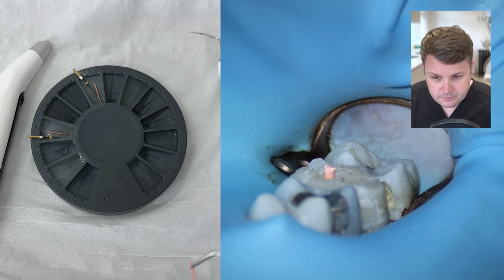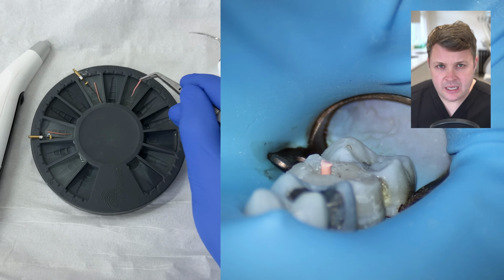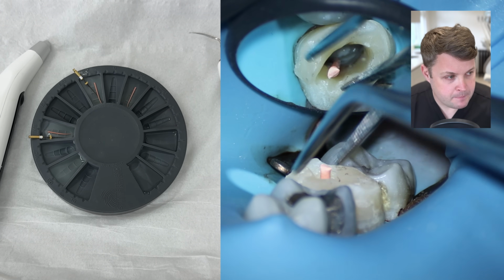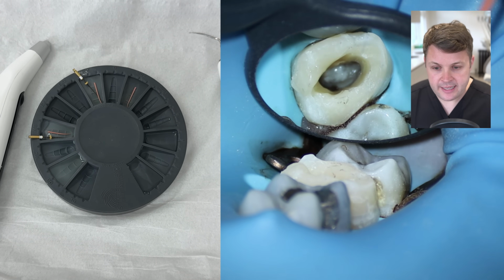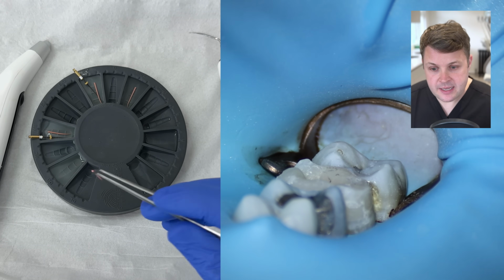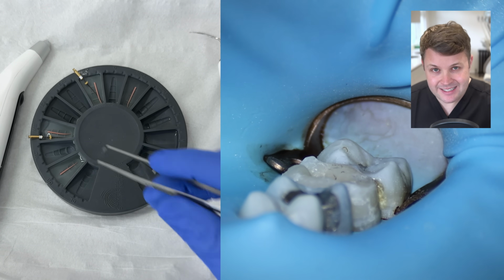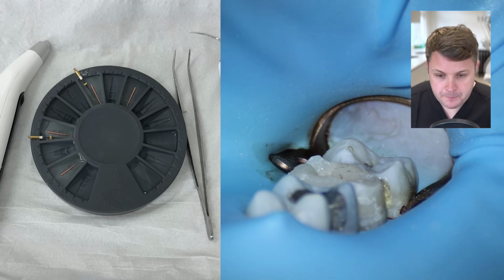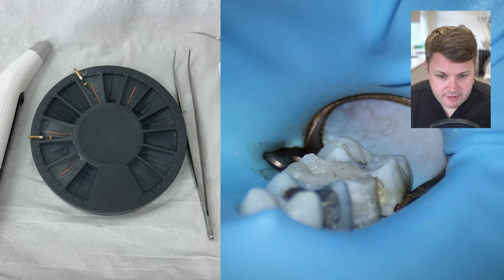A lot of the MB1, MB2 and the DB have a similar working length. So I'm going to use the same glide path file for all those 3, but the palatal is a bit longer, so I'm going to use a different glide path file for that. It's all about efficiency, essentially. And then we're going to do our final irrigation protocol.